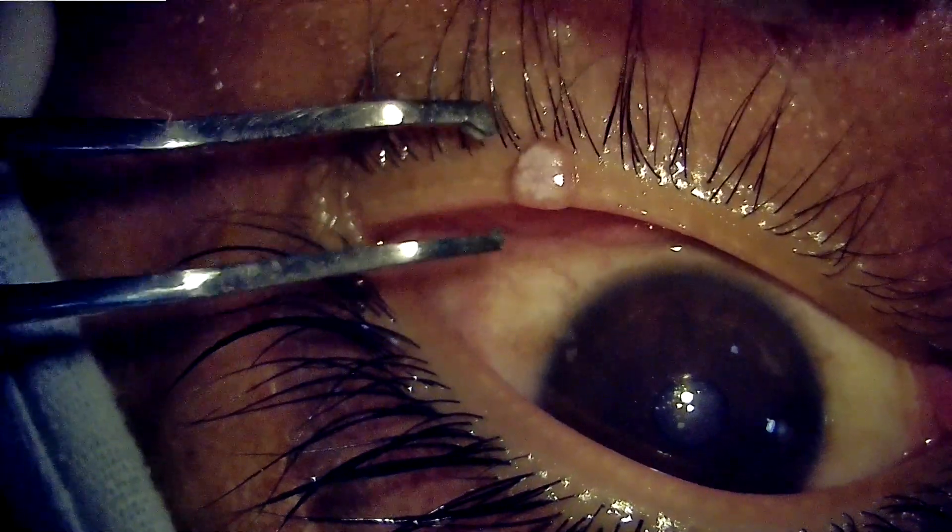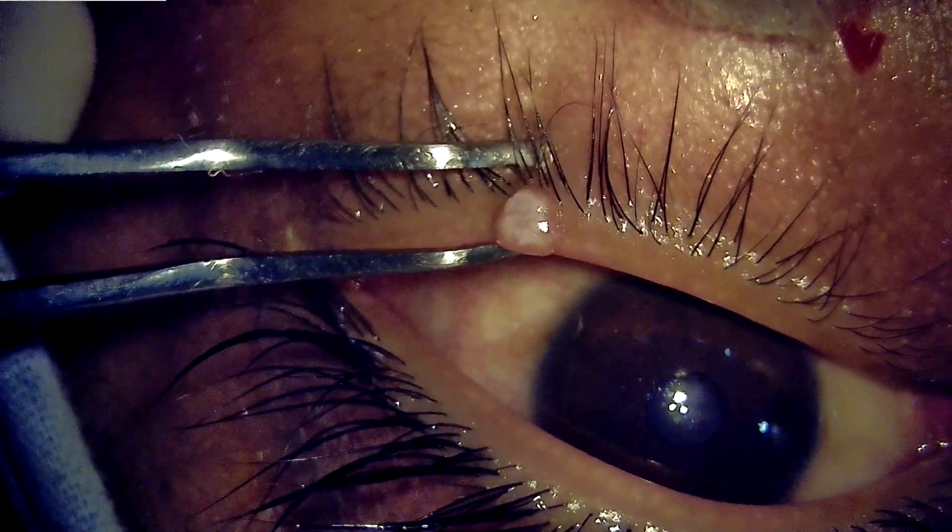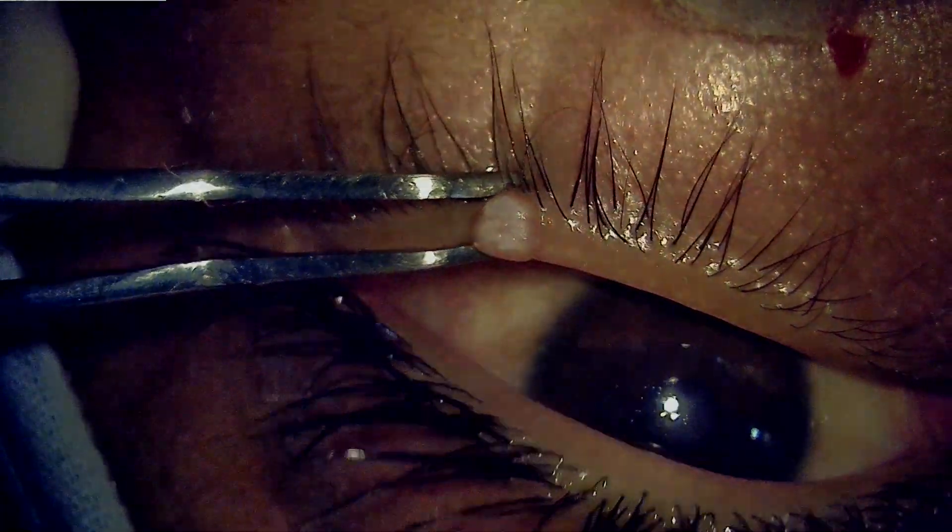If the patient reports any discomfort during this process, it is a sign that the anesthesia is probably not good enough.